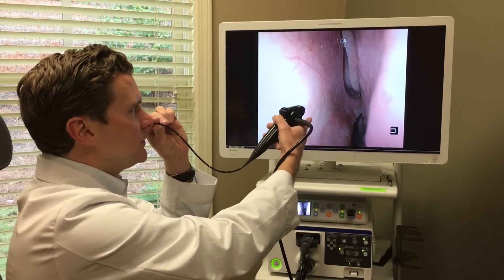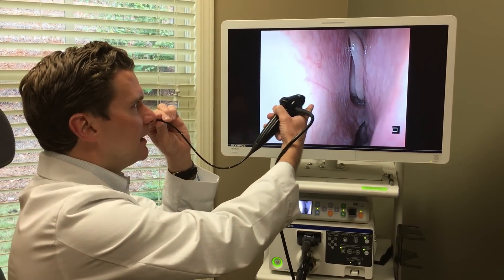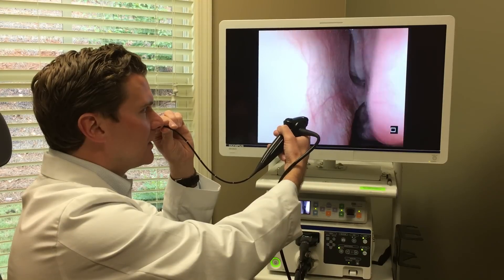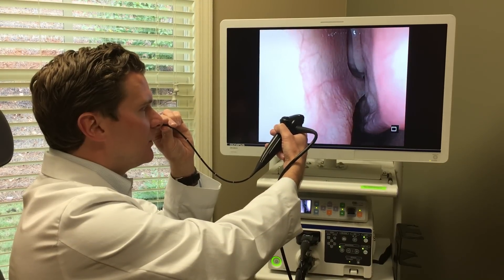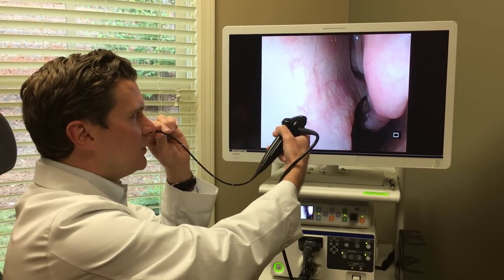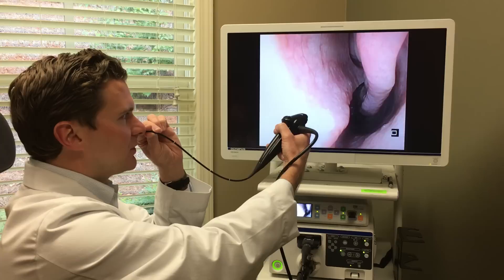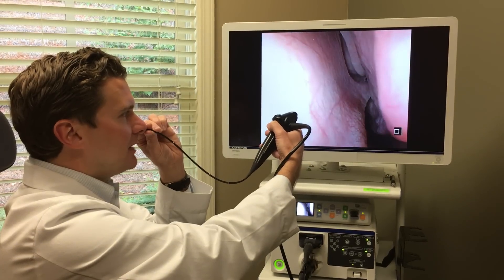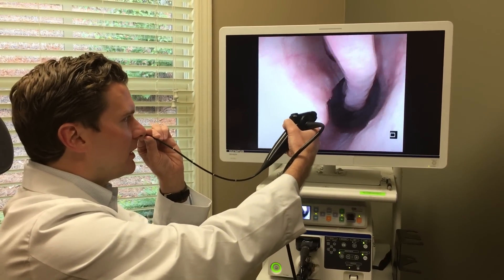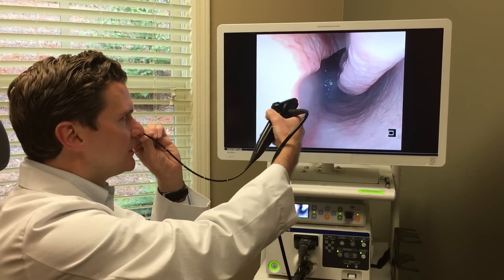As I go further in my nose you can see the middle turbinate there. You can see that septal spur kind of going over to the side wall of my nose. You only have to fix those if they give you significant trouble breathing, and I still have enough of a nasal airway in the lower part of my nose that it doesn't affect my breathing much.